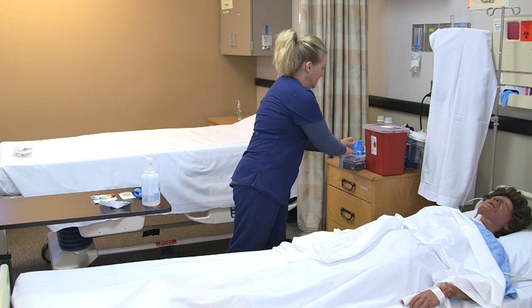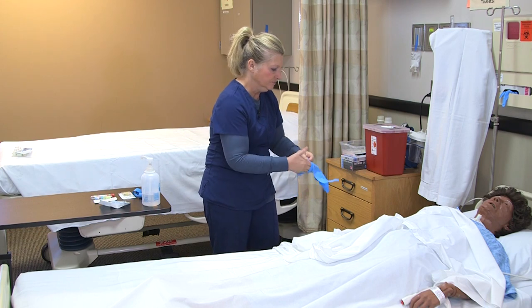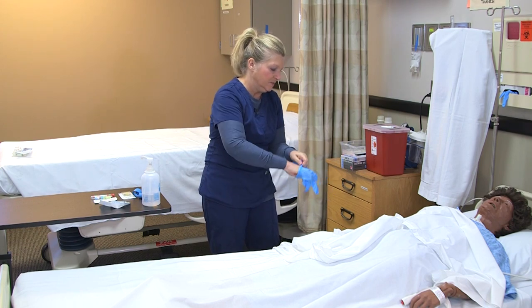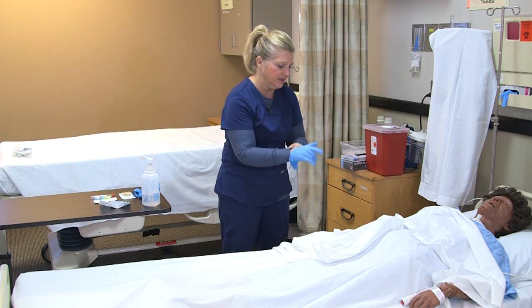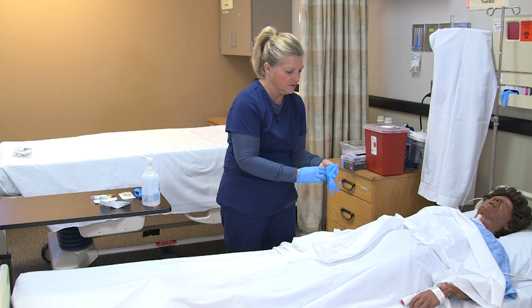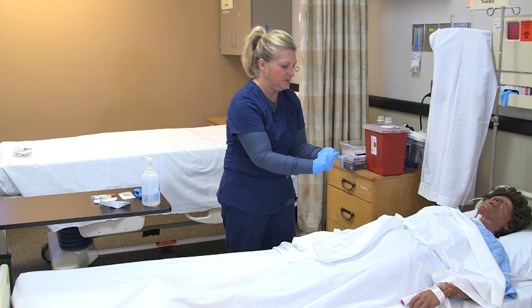You can adjust the bed to a working height. Apply any other PPE that might be necessary — if you suspect you might get any splash, you can put additional PPE on.